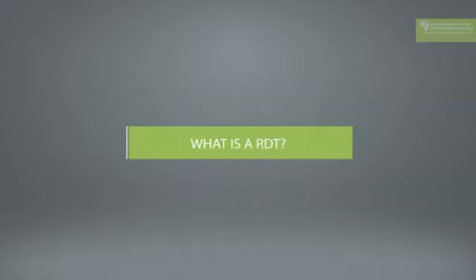Today we're going to take you through the process of using a malaria rapid diagnostic test to detect malaria. It's very important to use the test correctly to make sure that you diagnose malaria and so that the patient is treated for the right disease. Rapid diagnostic tests are very simple to use, but you need to follow very simple rules to make sure you get the correct result.